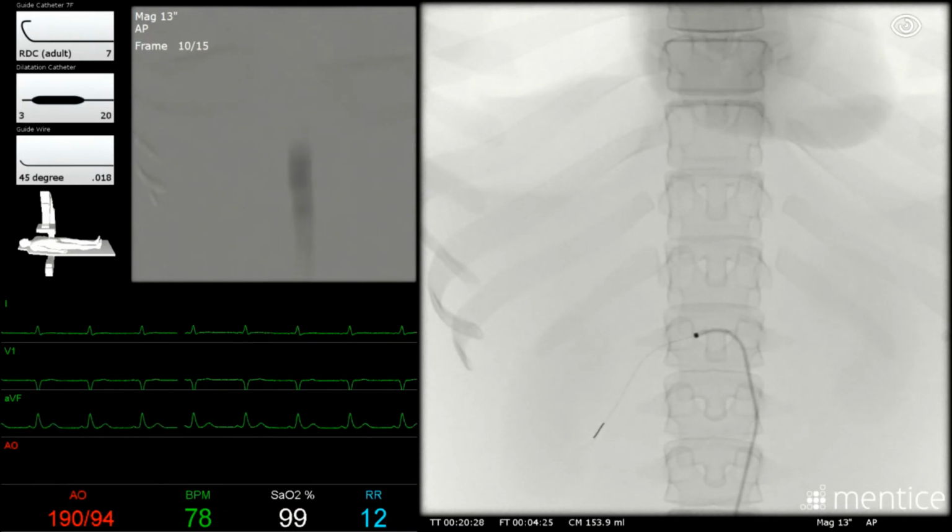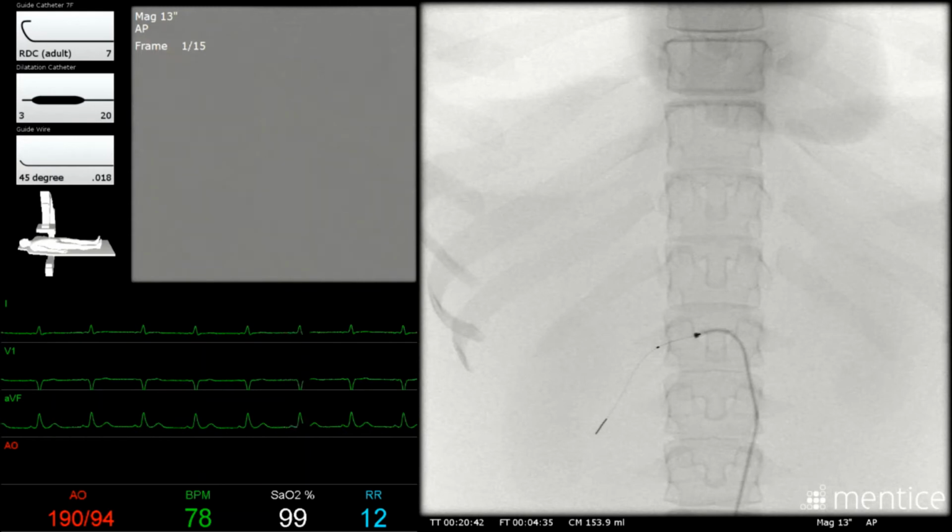stenosis. I'm first going to pre-dilate the vessel using a dilation catheter. This will expand the vessel to its native diameter, which will allow for optimal stent sizing. A real-life dilation catheter can be used in the machine for this, but I'm going to use the same 5 French catheter that I used as my Cobra, which will behave no differently in the simulation.